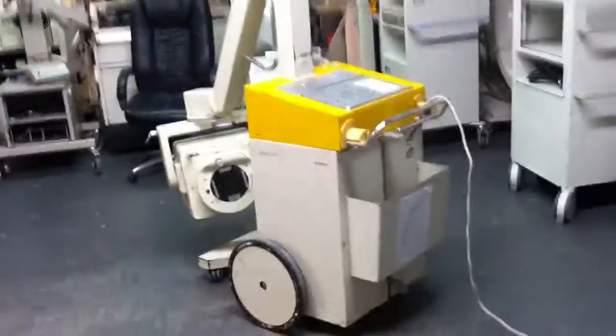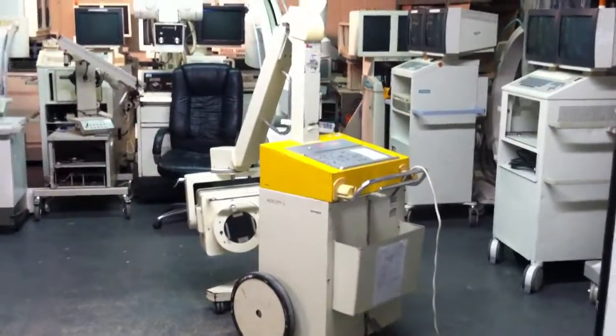This is a Siemens Mobilett II portable x-ray. It's in great working condition. It's a great purchase.